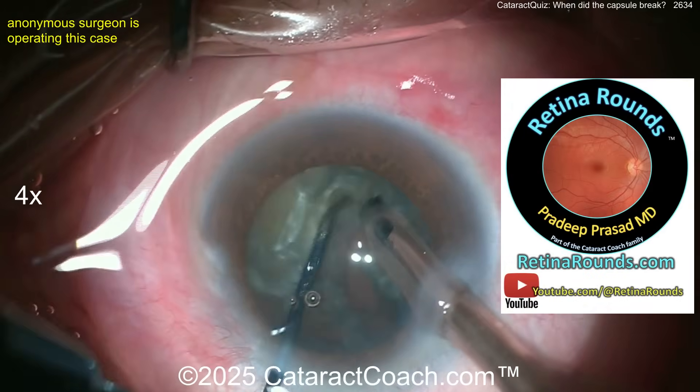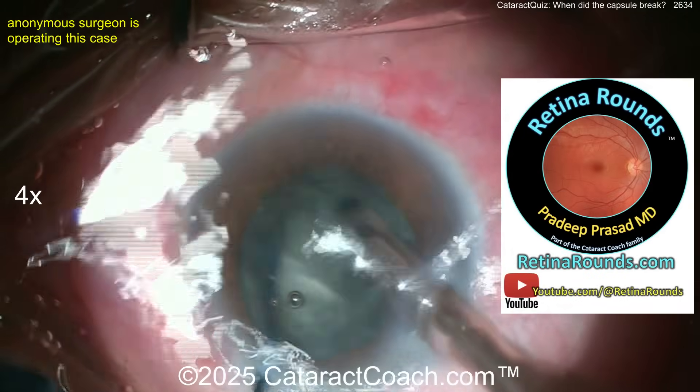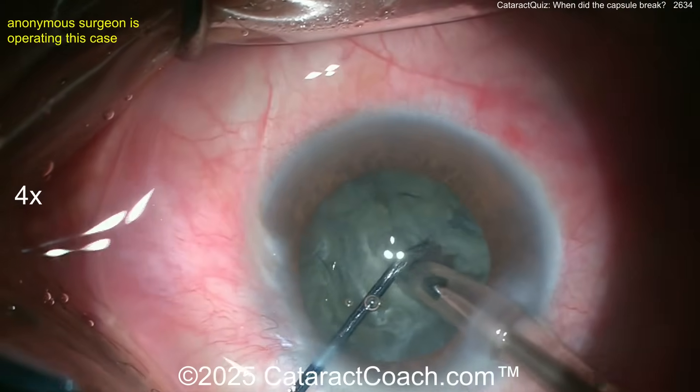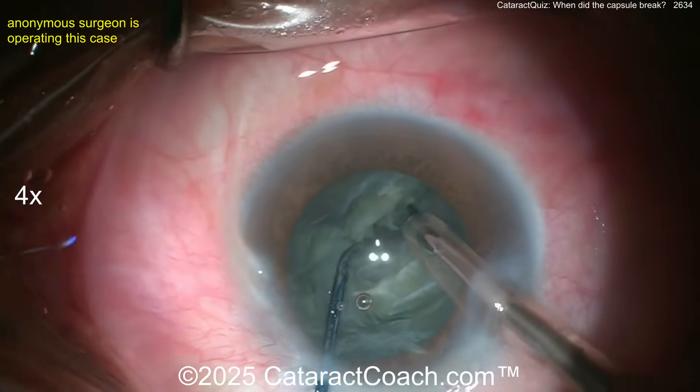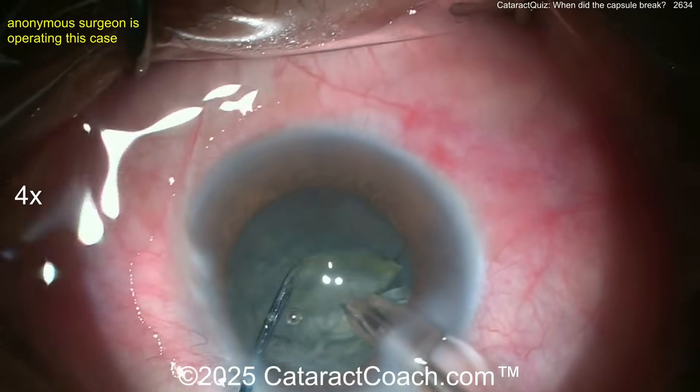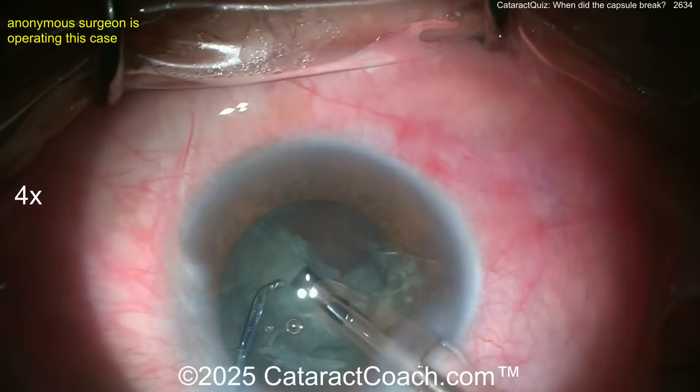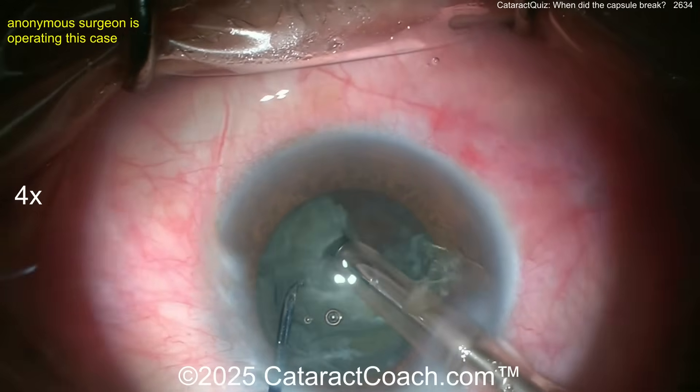Check out RetinaRounds.com, our sister channel — amazing even for a cataract surgeon. Now back to the case: having a little bit of a tough time splitting the nucleus, but it all looks pretty normal at this point. Now in higher vacuum mode, bringing the pieces up — looks like a stop-and-chop technique.